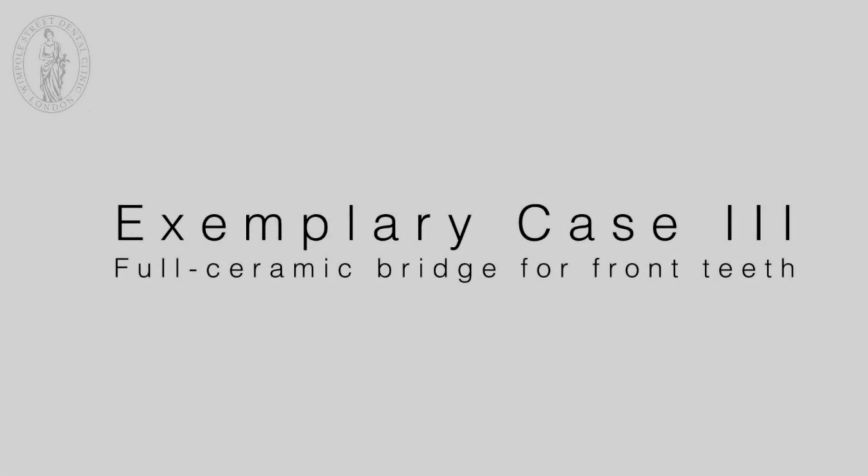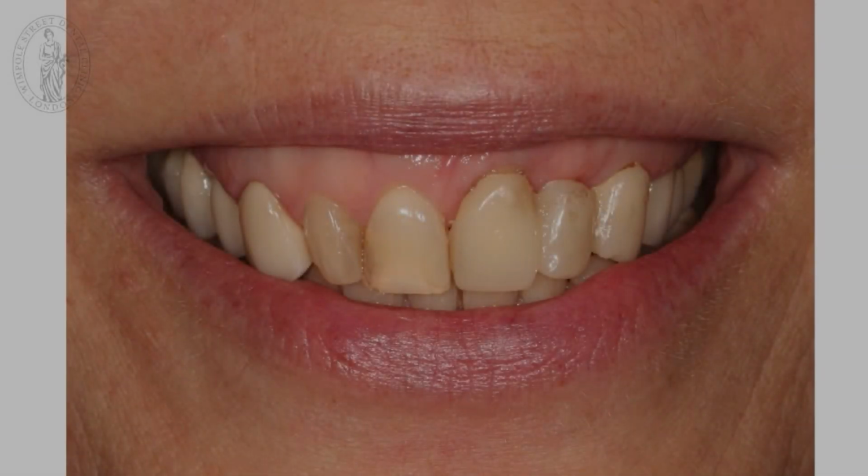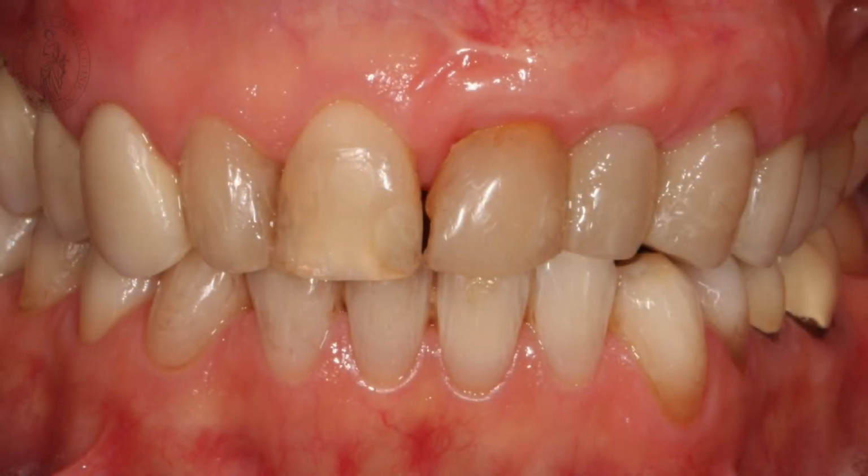Next case is a full ceramic bridge for front teeth. You can see for a dentist a very difficult situation where you have gum lines of different height, different color, and we decided to go all the way. That means adjust the gum lines, do orthodontics to put the teeth in proper position first, do a connective tissue graft from the palate to really level that out.